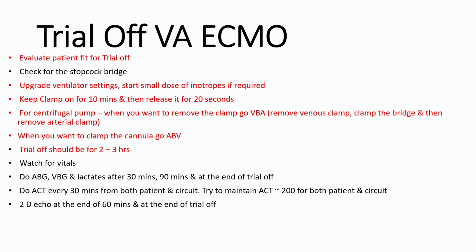Okay. During this process, I will show you how to make a bridge and how to connect the bridge once the patient is on ECMO. You need to know how to put a bridge first, and once you put the bridge, then you have to disconnect the patient from the ECMO for some time. Okay. So just a minute, I'll show you how to make the bridge.